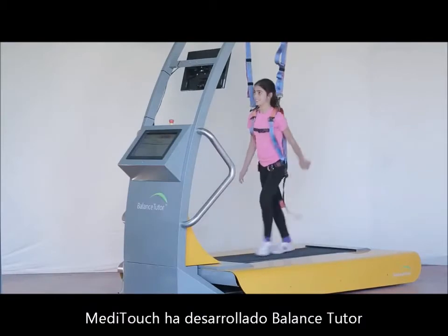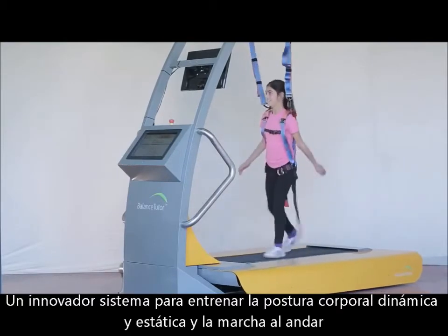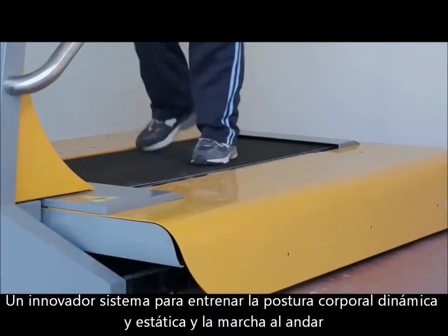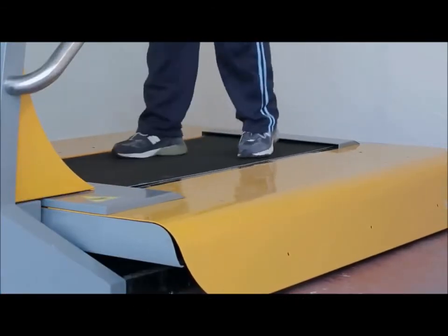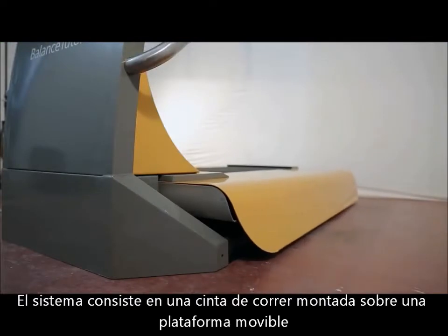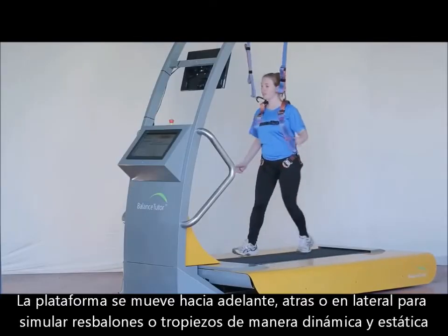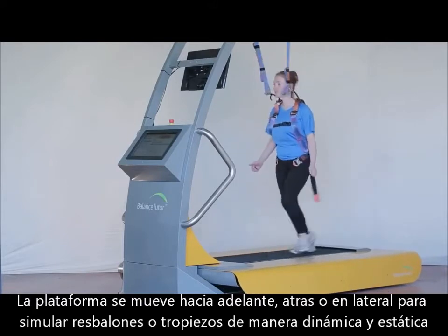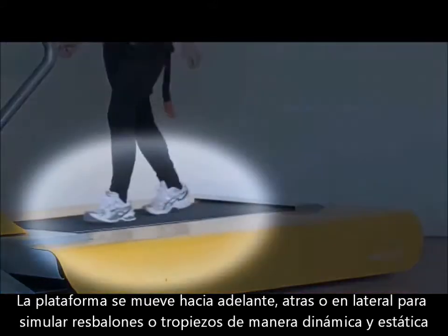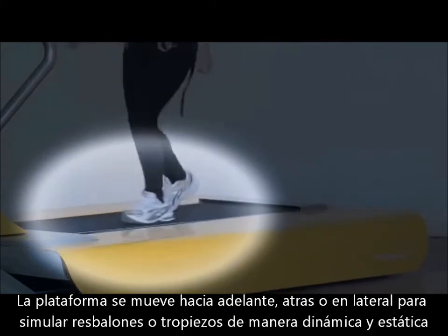Medi-Touch has developed the Balance Tutor, an innovative dynamic and static postural control and gait trainer. The system consists of a treadmill mounted on a moving force plate platform. The platform moves in the medial-lateral and forward-backward planes to simulate a slip and a trip in both the static and dynamic mode.